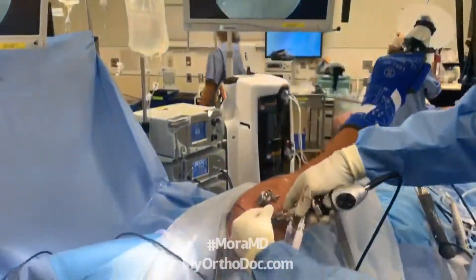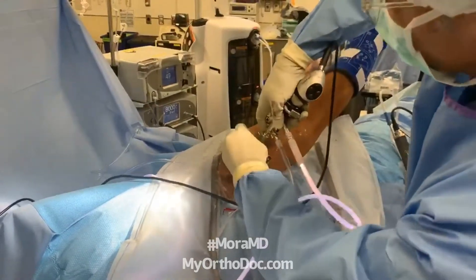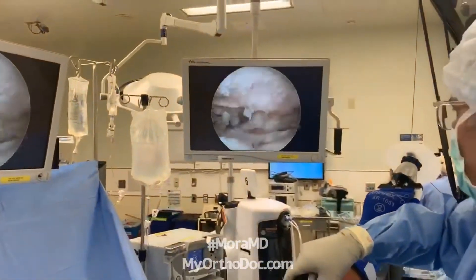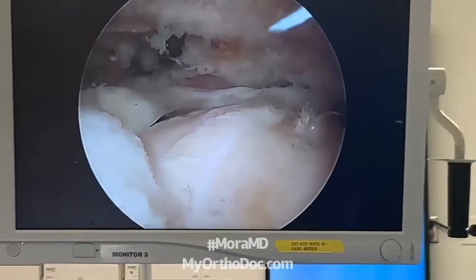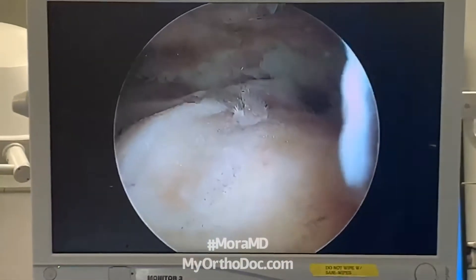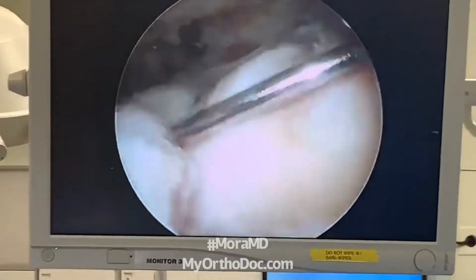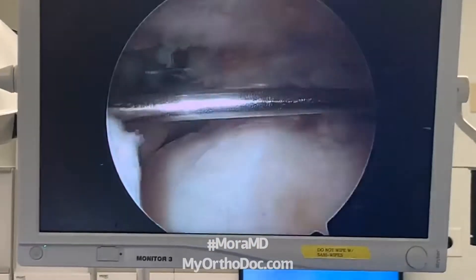Now I can do a little switcheroo — I take my camera from this viewing portal, which is not in the ideal spot, and I move it over here. Now I have a better view of my tear, and I'm thinking about how I'm going to repair this tendon. I'm going to create another portal right here so that I can grab this tendon and pull it that way.